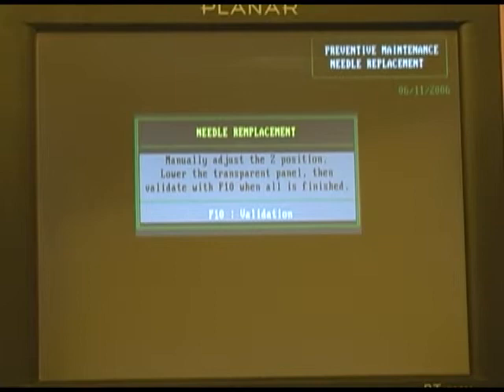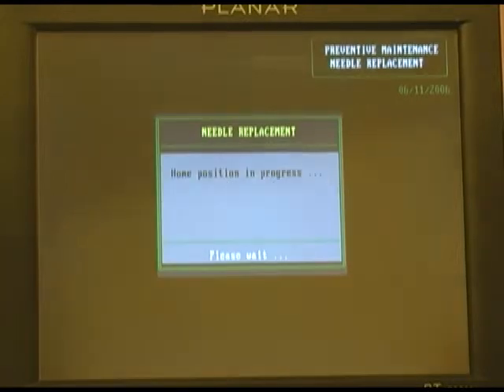Now you're going to physically lower the needle by pushing the needle down into that mapping cuvette tool. It can no longer go in the downward direction. Once you've completed that, you're going to again hit F10 to validate the process.